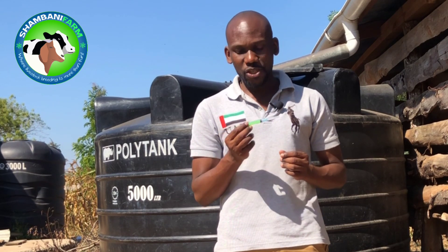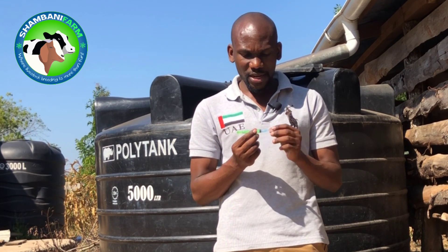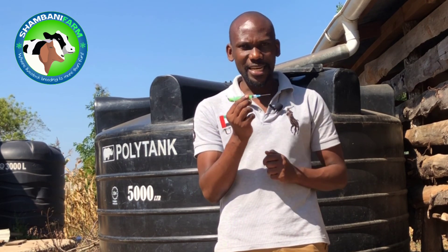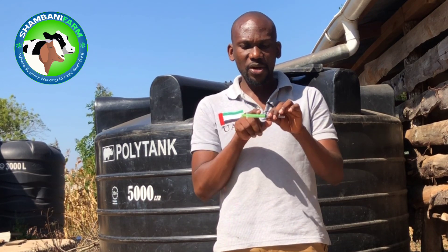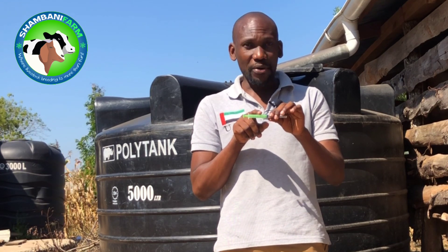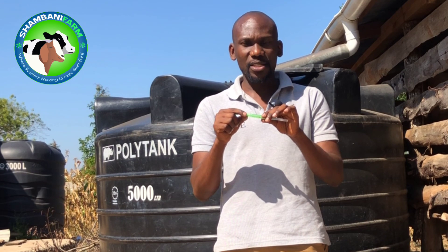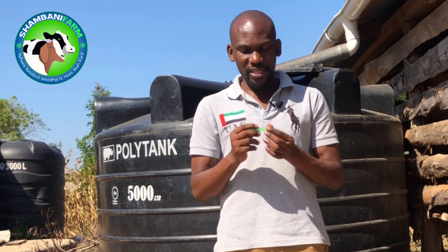A syringe has three parts. The first part is this pointed part — the needle. The second part is the middle part with the measurement markings, called the barrel. The last part is the end part, called the plunger.